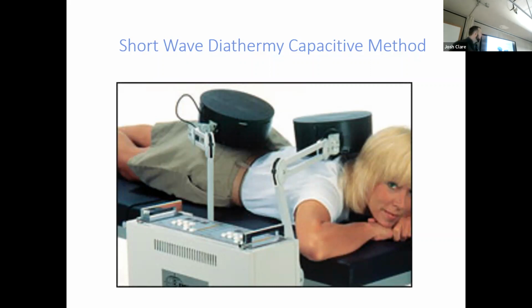It's not safe that she's wearing a belt, because you said this intervention is no metal. No metal. There might not be metal on the belt. If there is, I would remove it. Yeah. She's also wearing contact lenses. Can't do that.